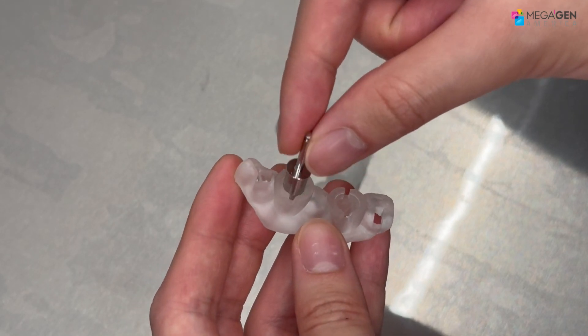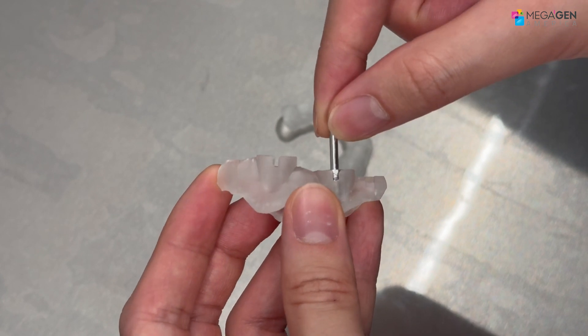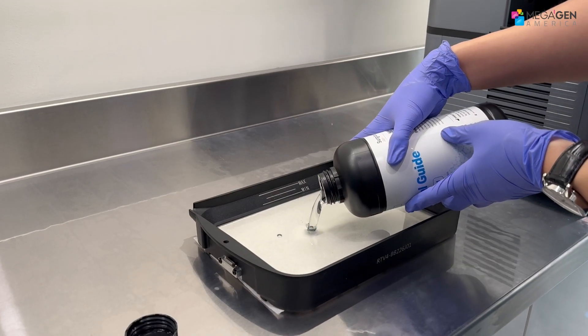I'll go straight into the process of printing out a surgical guide planned and designed from R2Gate software and printed from a Shining 3D L4D printer.